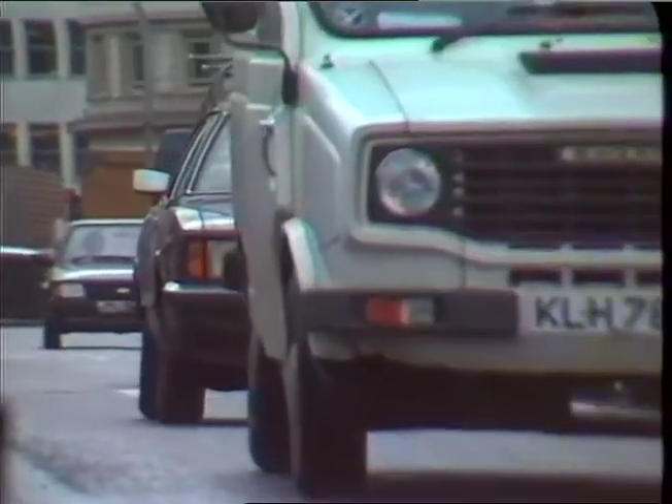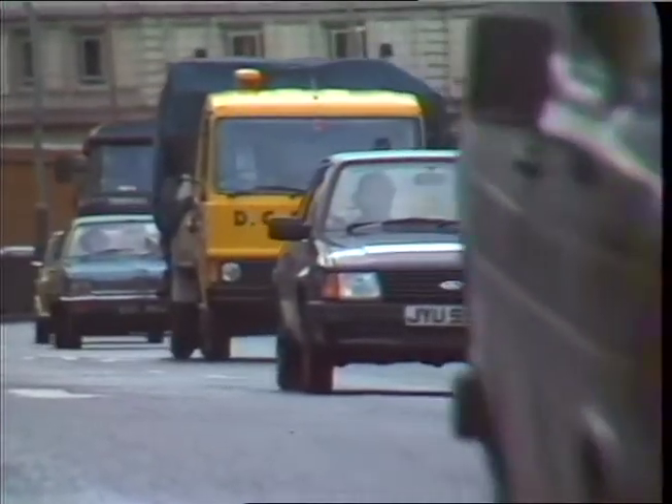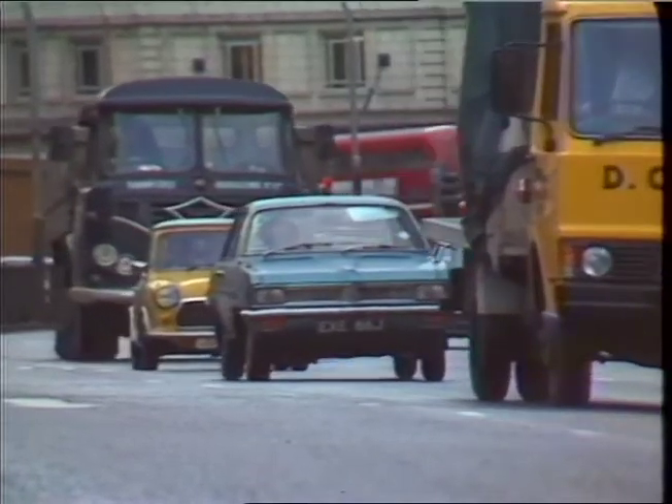They sell for around £300, though they're being sold free here on certain cars. If you want one though, the full production models aren't yet available. Christopher Rainbow for Thames News.